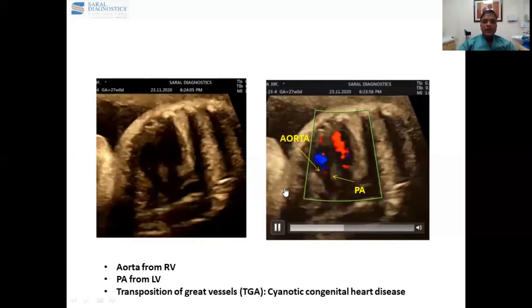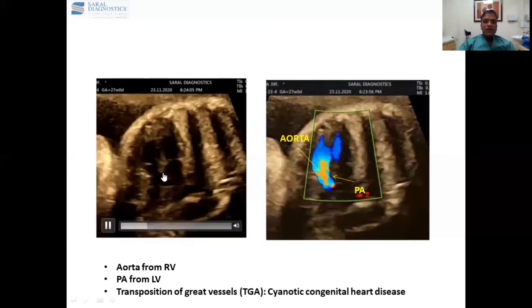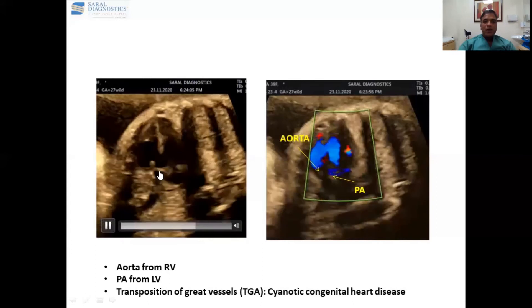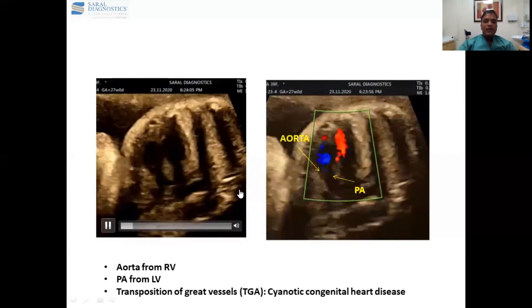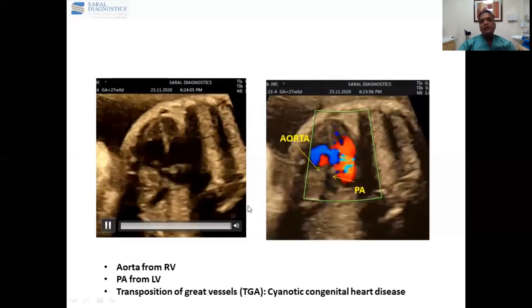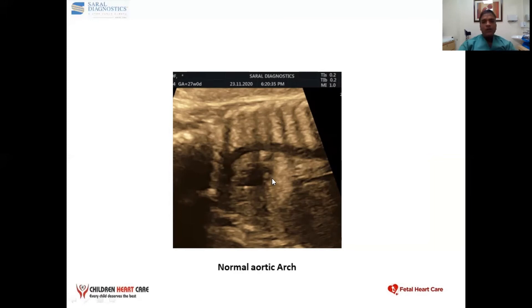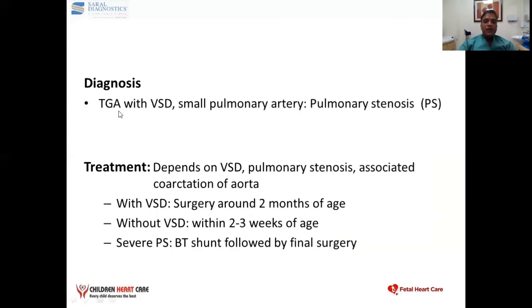This was a case of transposition of great vessels. The pulmonary artery is also small in size. Normally the pulmonary artery is bigger in size compared to the aorta, but here the aorta is bigger compared to the pulmonary artery. We also need to assess the aorta for any coarctation. As you can see here, there is no coarctation — the aorta is of similar size along its whole length.